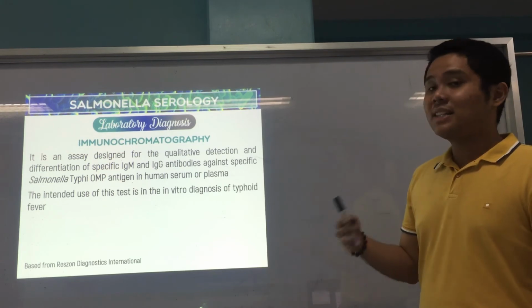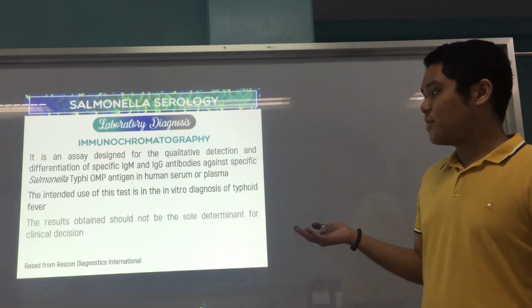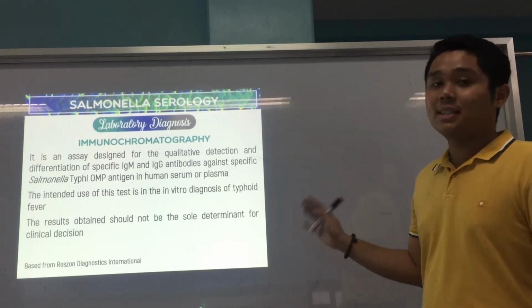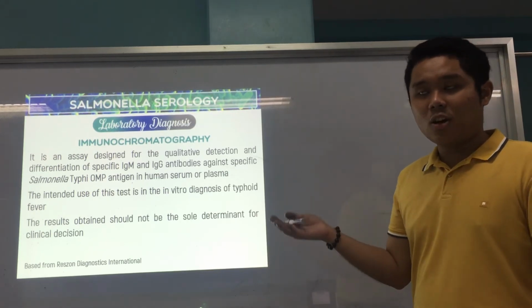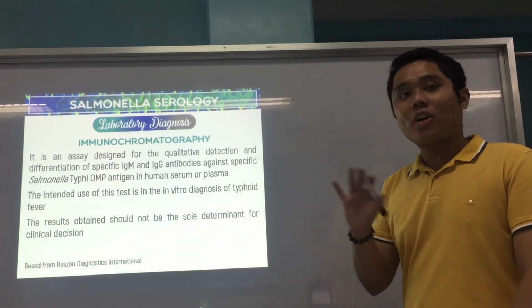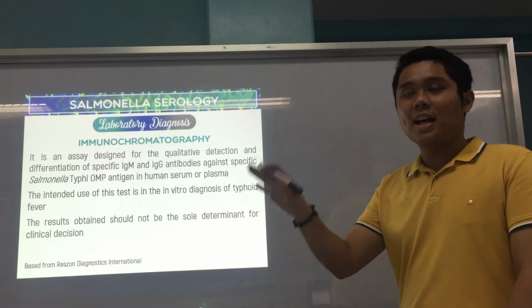So the intended use is in vitro diagnosis of typhoid fever, and the results obtained should not be the sole determinant again for clinical decision. Again, it's in the hands of the doctors what to do with the results. Because again, it needs correlation with the symptoms, history, and so on.